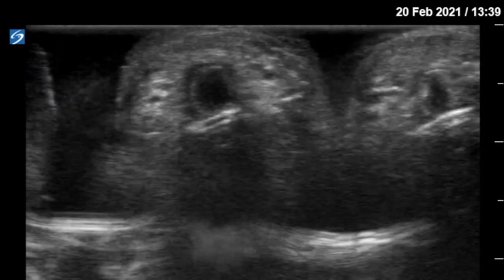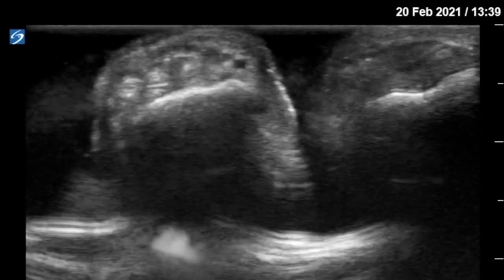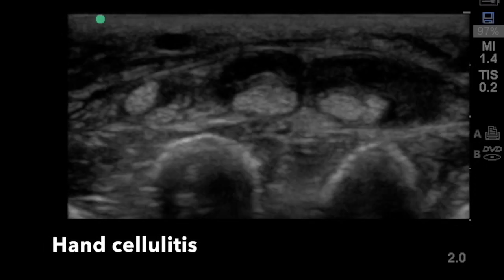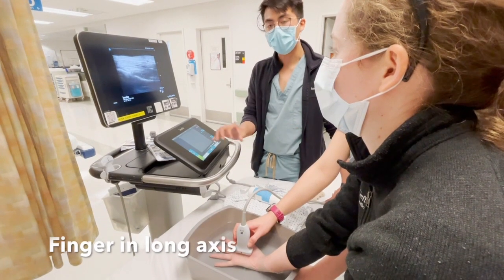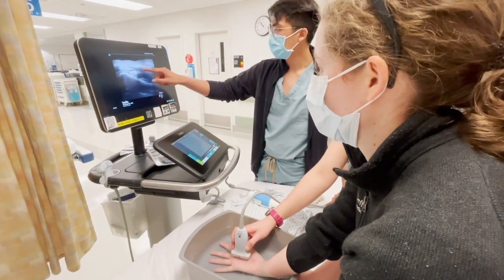As you continue to slide the probe towards the fingertips, you'll find the MCP joint, the PIP, and DIP joints as well. This is an example of hand infection where you have anechoic fluid not only in the tendon sheath but around the soft tissue above.